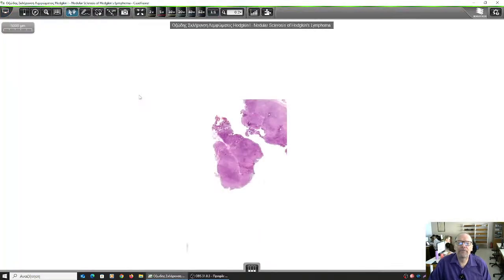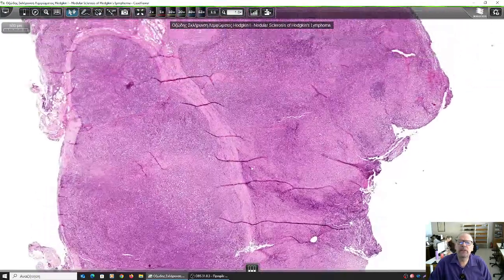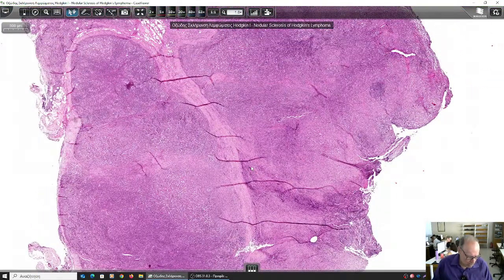Now, we have this lymph node, possibly from the mediastinum. What's the easily discernible abnormal feature in this lymph node? What is there? You see that it is not compatible with normal lymph node architecture and morphology. This is something strange. It could be a capsule, of course, because it's connective tissue, but it is not. It comes within the node, so it is no longer a capsule.